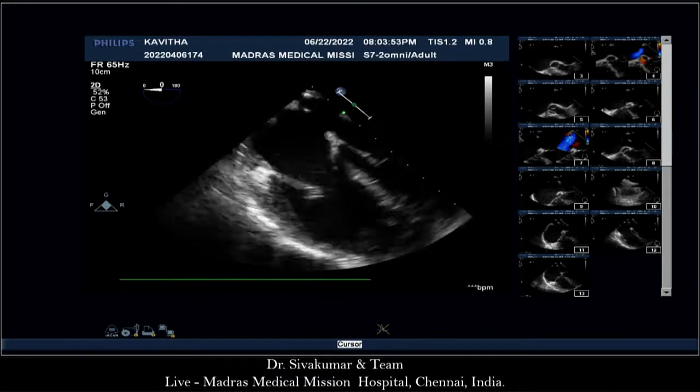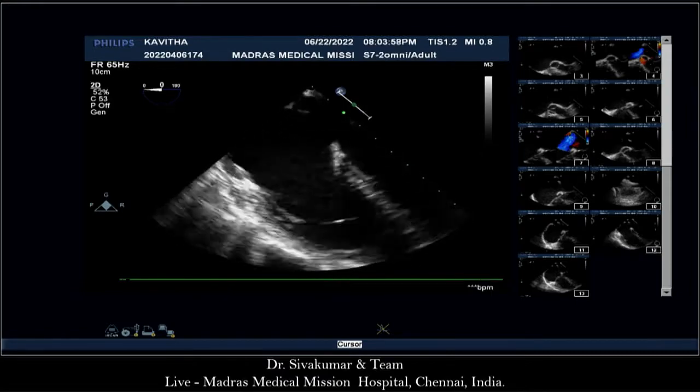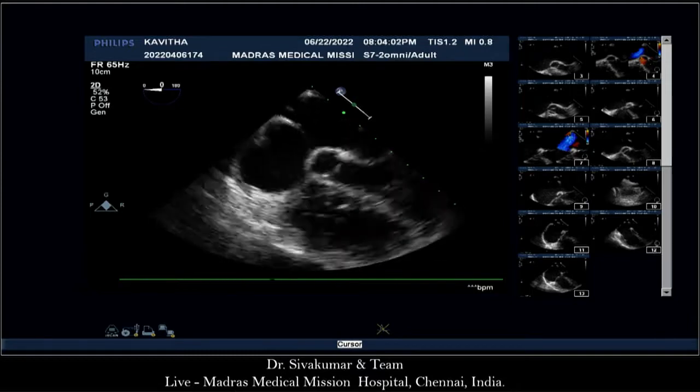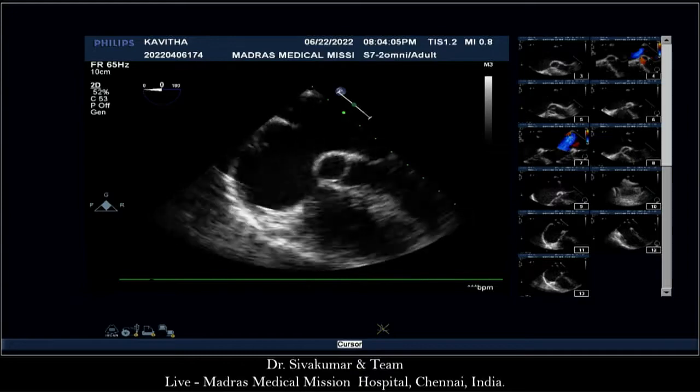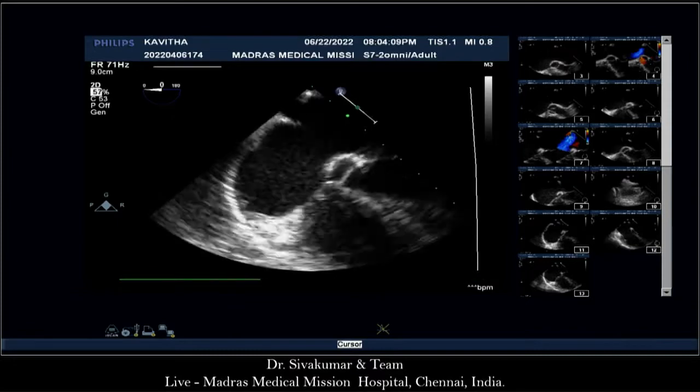How old is the patient? Patient is an adult. 21 years. 21-year-old. Is your wire across it, Shiva? Yes, not sheath across, wire across. But I can take it out. I can make it easier for you. The retroaortic rim is okay, bald. Now there is nothing inside.